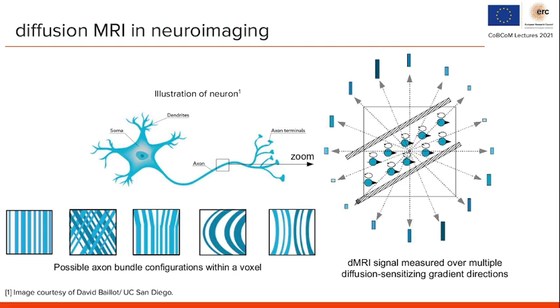Diffusion MRI signals measured along the gradient direction, which is perpendicular to the axon, will have high value since diffusion of the molecules along that direction is restricted. On the other side, a signal measured along axon will have low value due to non-restricted molecule diffusion.